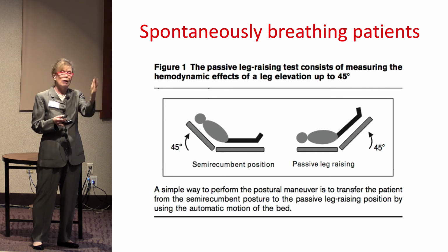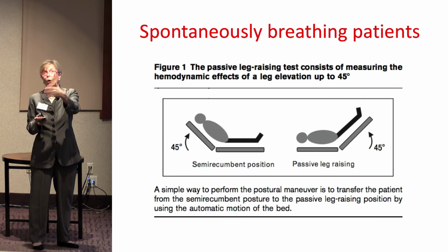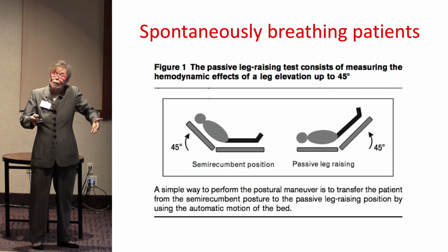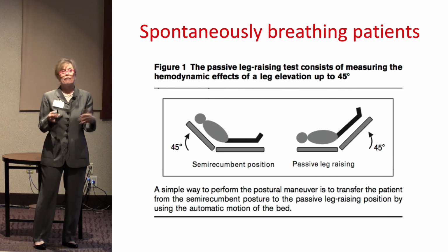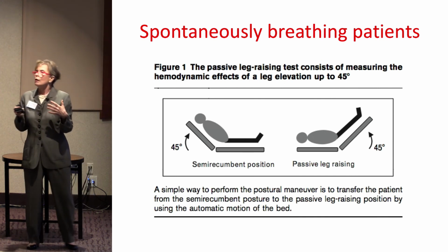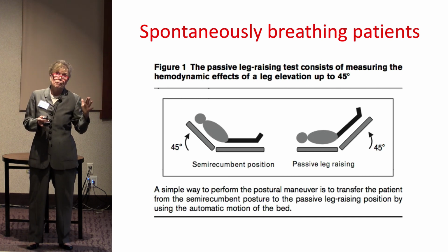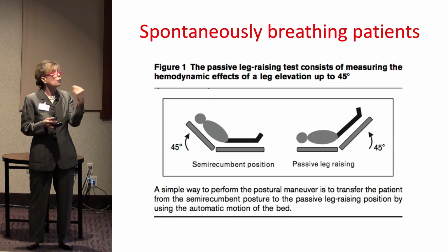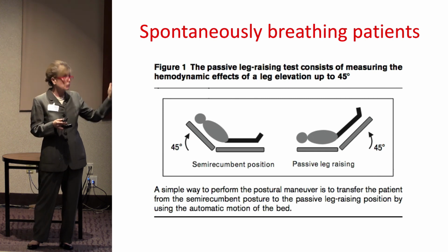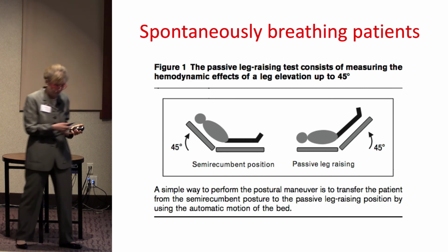So what you expect to see, you always will expect, you hope, to see that when you lift the legs, that actually the stroke volume will go up. But because you also want to evaluate, it's not just because I lifted your legs, stimulated you, did something else. That's why we return patients back to the semi-recumbent position, because then that actually tells us whether or not this was actually a patient who is responding to their self-delivered bolus of 300 to 500 mLs of fluid.